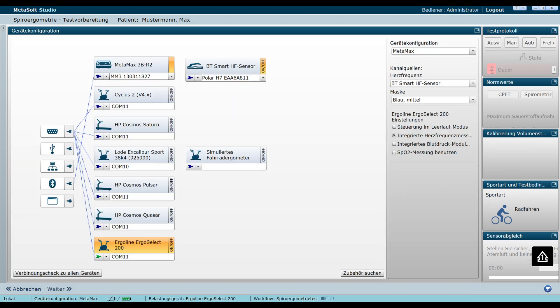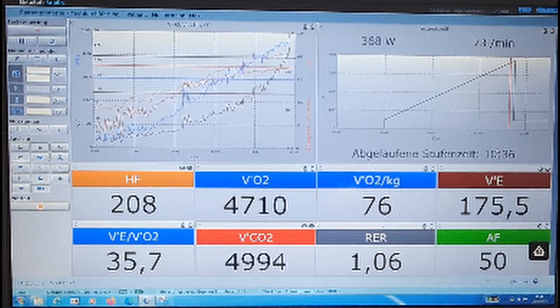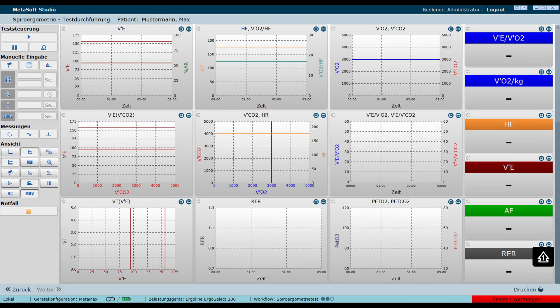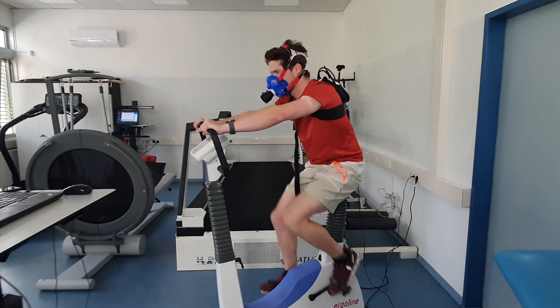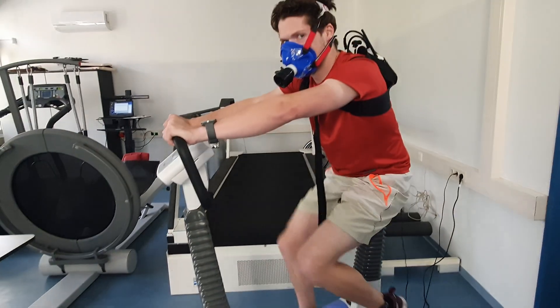In the device configuration window, the connectivity of the individual devices can be checked. If all devices are connected and there is no error message, the test page opens at the bottom right edge. The views can be changed. Spiroergometry is started by starting the test, and the actual spiroergometry begins according to the settings selected in MetaSoft Studio.